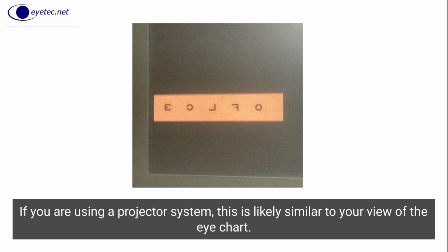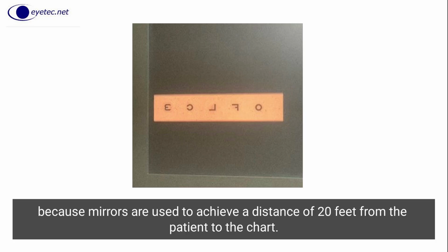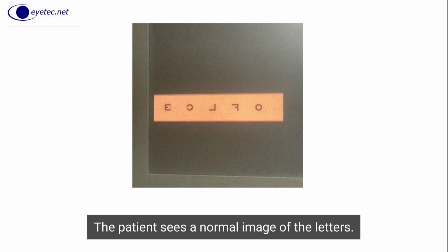If you are using a projector system, this is likely similar to your view of the eye chart. The letters appear backwards to you because mirrors are used to achieve a distance of 20 feet from the patient to the chart. The patient sees a normal image of the letters.